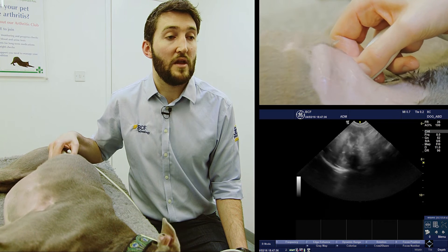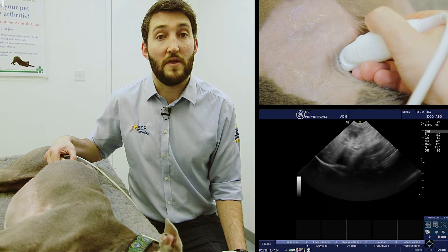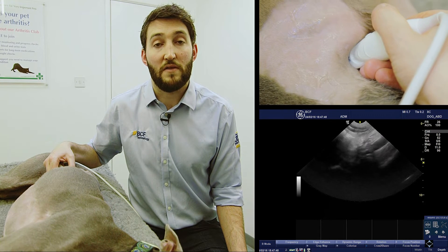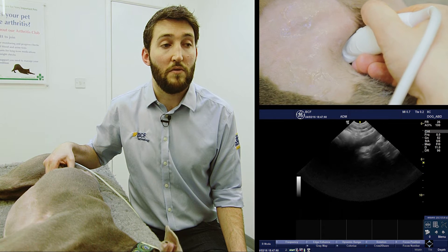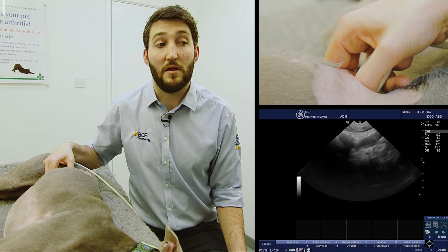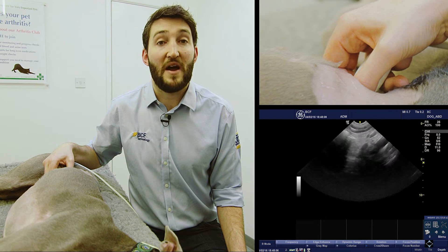Once you find the right kidney, we're going to try to get it in the center of the image, then fan dorsally off the dorsal border of the kidney. Keeping that kidney in the center of the image, we're going to fan gradually back ventrally. The first large vessel we come to — just visible on screen here — is the aorta. Then as we fan more ventrally, once that intestinal gas has moved out of the way, we'll see another vessel appearing on screen — that's our vena cava.